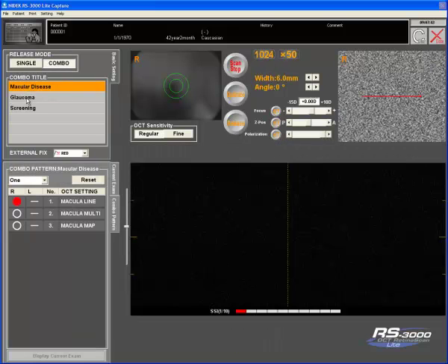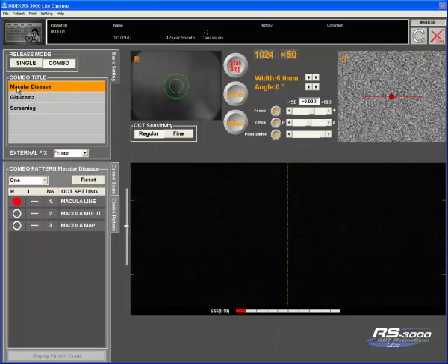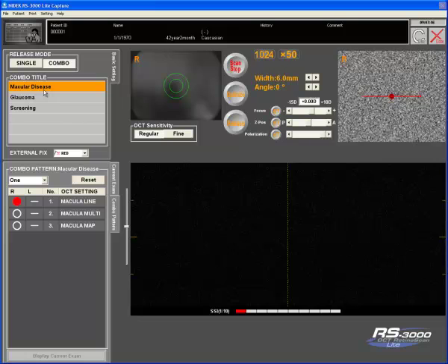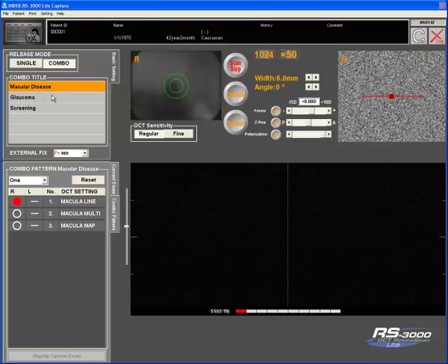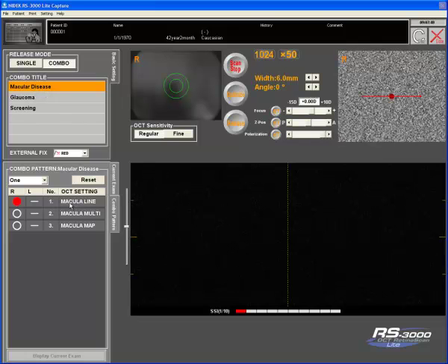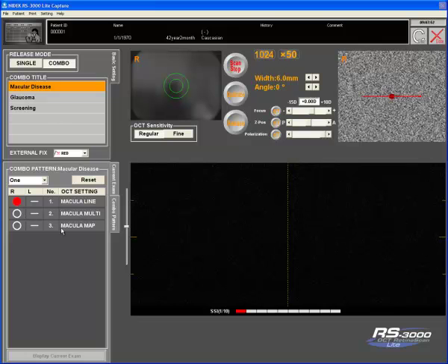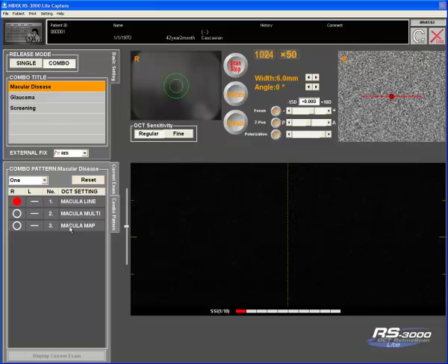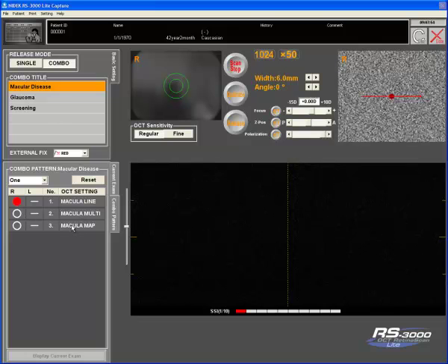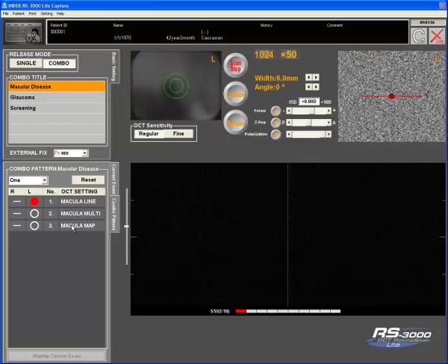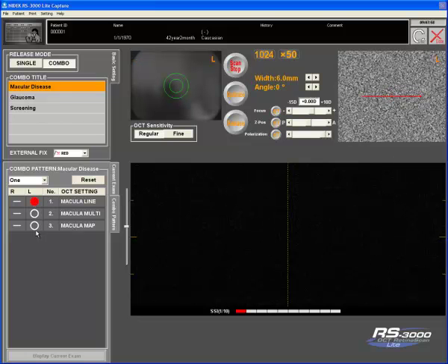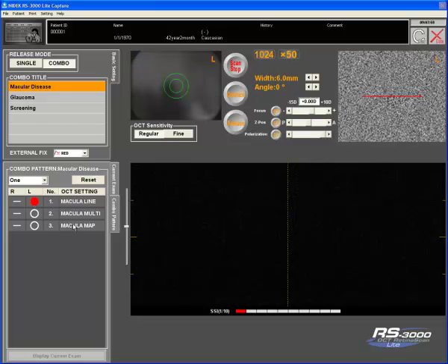You can set up different titles. So for this one, for example, macular disease, it will perform a right macular line and immediately move on to a right macular multi and then on to a right macula map. Moving the machine to the left eye, it will automatically move over to the left eye as well.